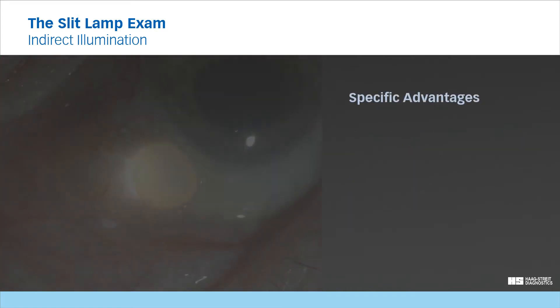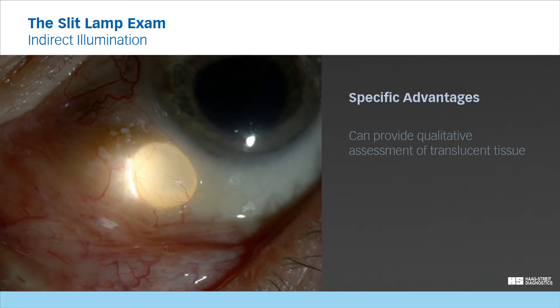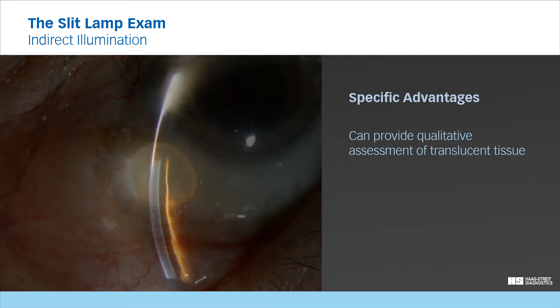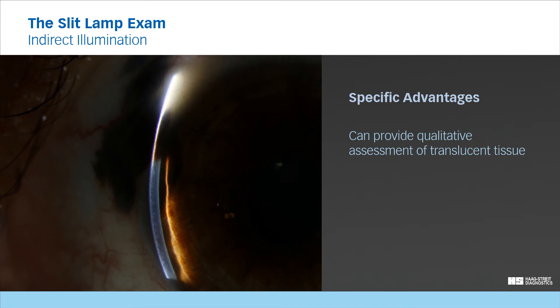Specific advantages. Indirect illumination can provide a qualitative assessment of translucent tissues, such as in this conjunctiva. The scattered light fills and illuminates the entire lesion to show that it's filled with clear fluid and that there is no blood or scar tissue present. In contrast, this is an example where the light is absorbed by the pigment in the melanoma and does not scatter through the opaque lesion into the surrounding structure.